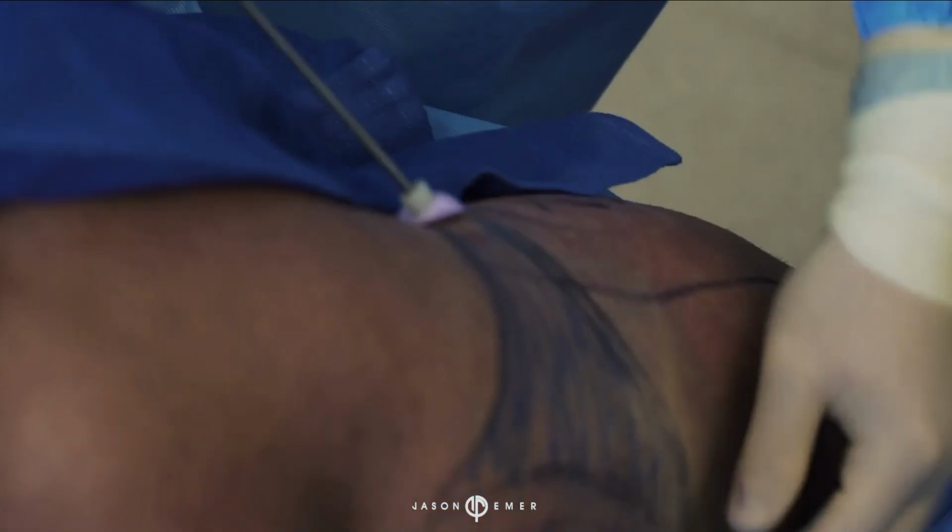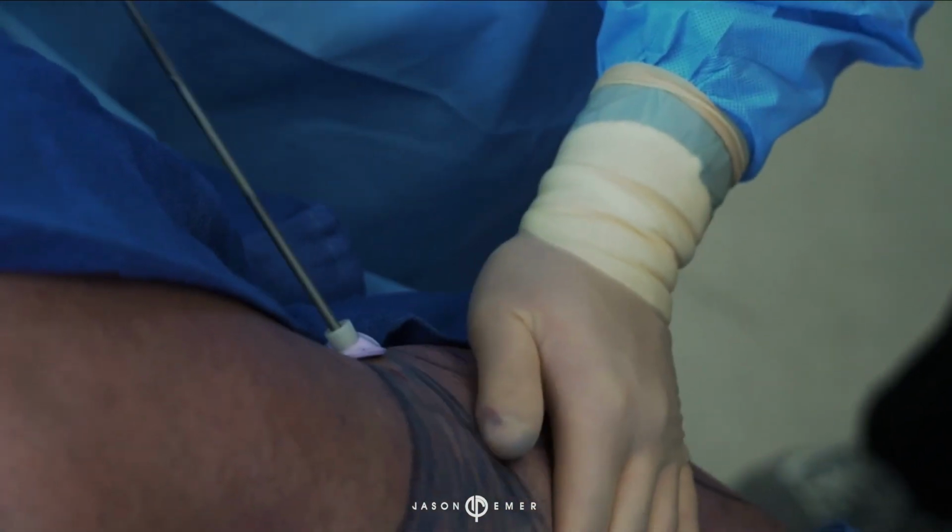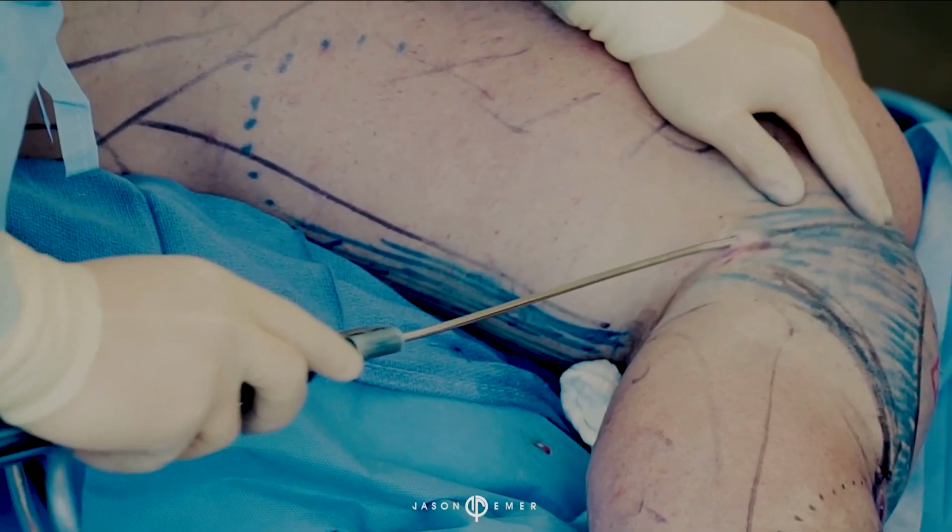His triceps right here, his biceps over there, so we're going to create a nice wedge here where it's going to be an irregularity that we have planned, so he looks way more sculpted.